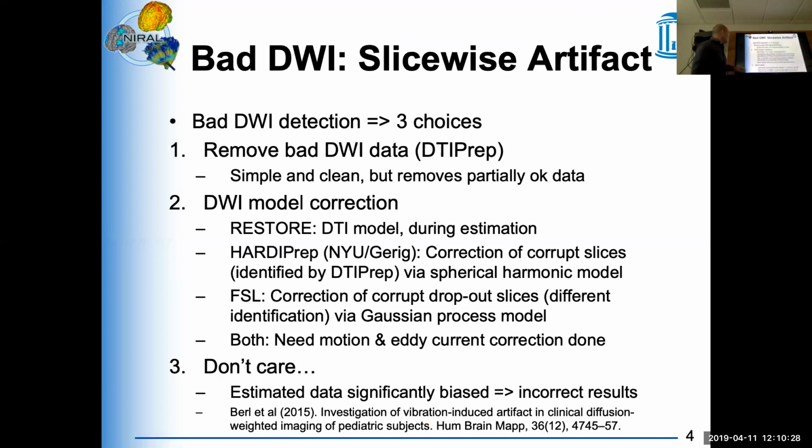There's another option that I mention here: if you are only interested in doing DTI, rather than solving it up front when you do the QC, you can also solve it on the back end when you're doing the diffusion tensor estimation. So you can do that estimation in a very robust way. That method is called RESTORE. It's from NIH, from Carlo Pierpaoli's group. It's in TORTOISE, is the tool called. It estimates the DTI model in a very nice, robust way that rejects outliers, etc. And it even quantifies those outliers. It provides an outlier map and things like that.